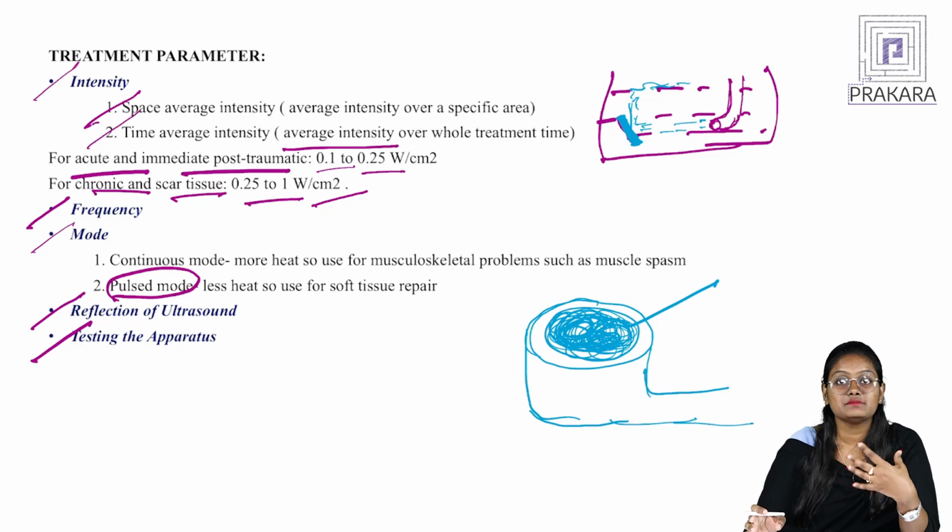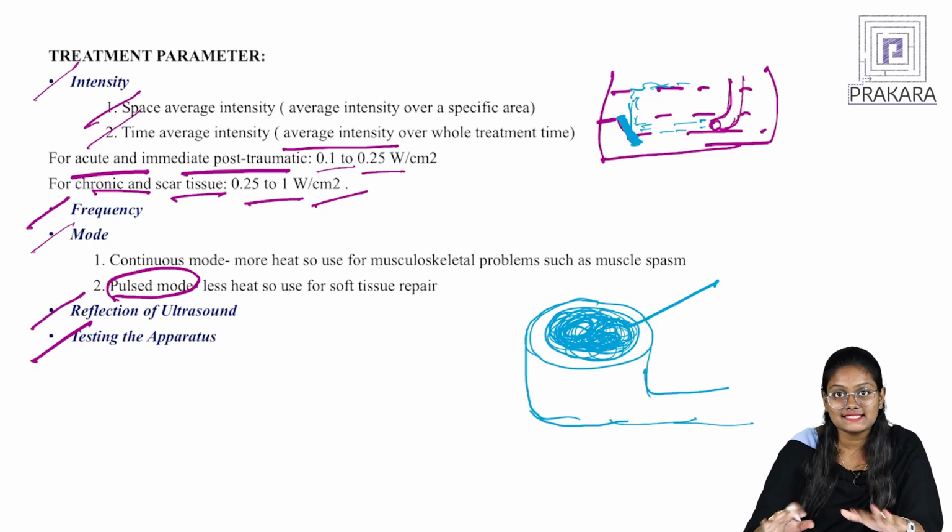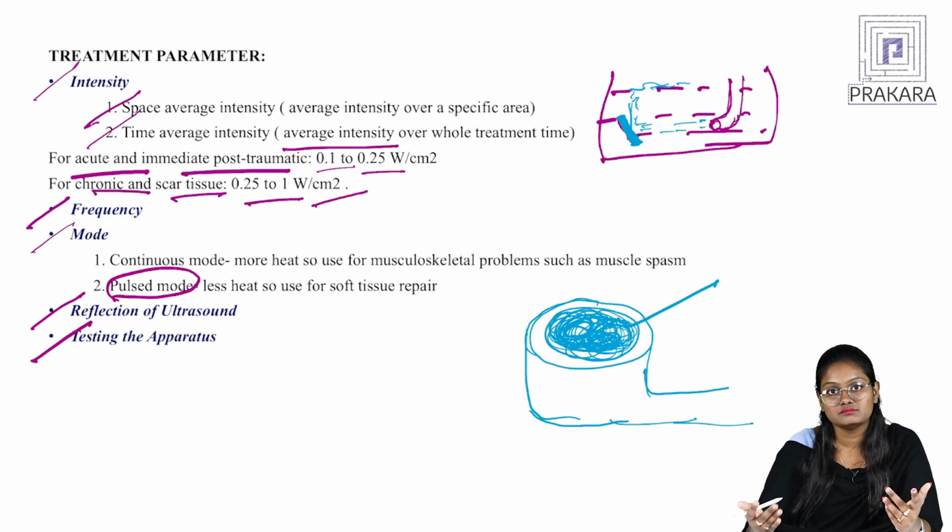If the water doesn't move and just stays still, then that means the ultrasound machine is not working. So that is how you test your apparatus, through two different methods. You can go for whichever is easier for you to do.